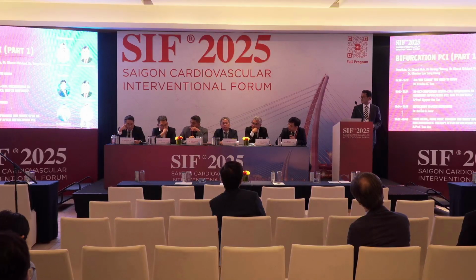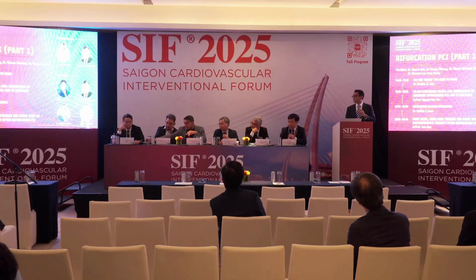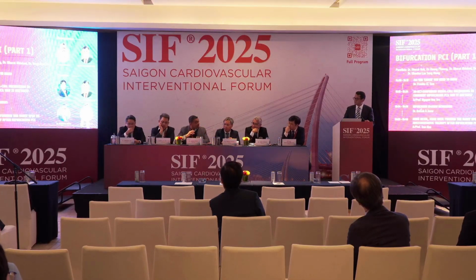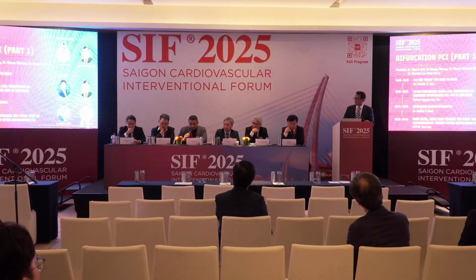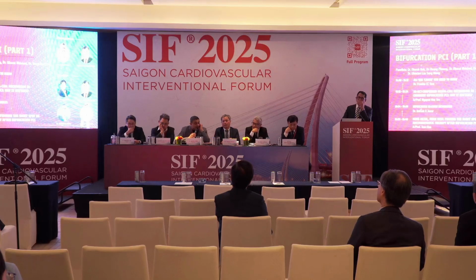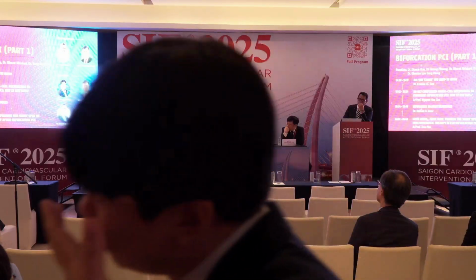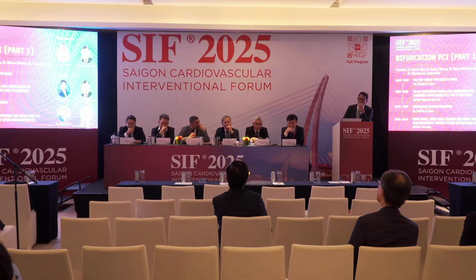Any comment from the panelists, please? Excellent presentation. I guess we all have these patients who keep coming back every once in a while for repeat procedures, having had a small stent put in. If it's a very old stent from several years ago, and the patient comes in, of course no imaging was done previously, and now you've realized that it's massively undersized, how hard would you push it to get to those parameters that are specified there? Because sometimes it comes with a bigger risk as well, with all the calcification.